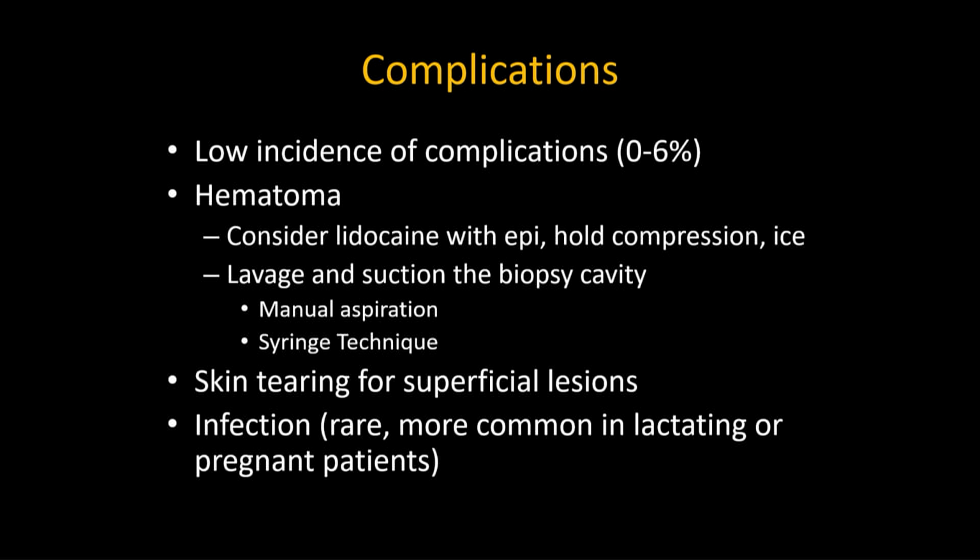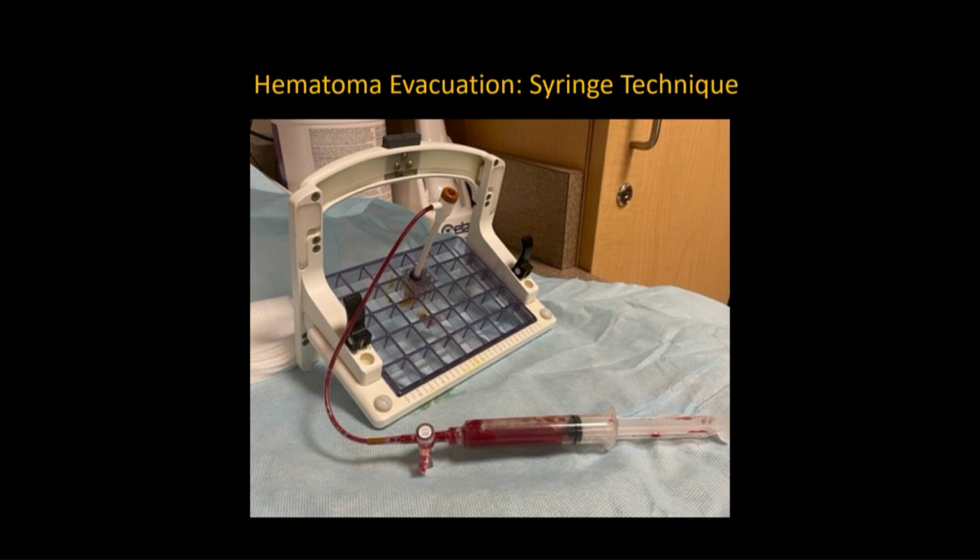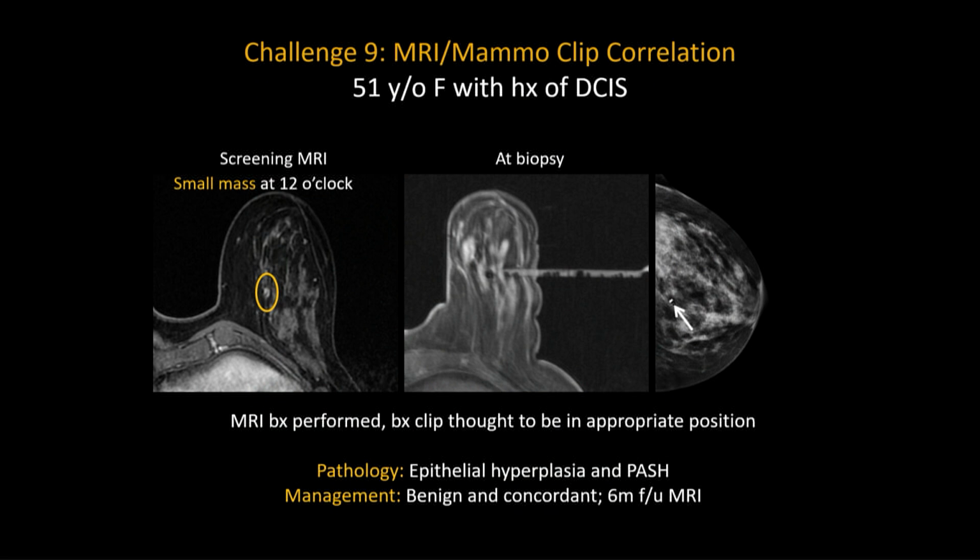Complications also include skin tearing for superficial lesions and infection. This is rare, but we do see it in lactating or pregnant patients. And so this is the hematoma evacuation using our syringe technique, where a syringe is placed at the stopcock. And this is when the patient is in the biopsy itself, and then we just suction out the hematoma.